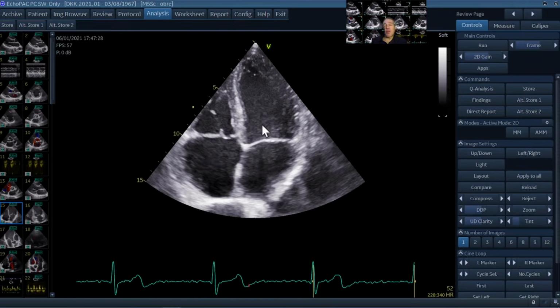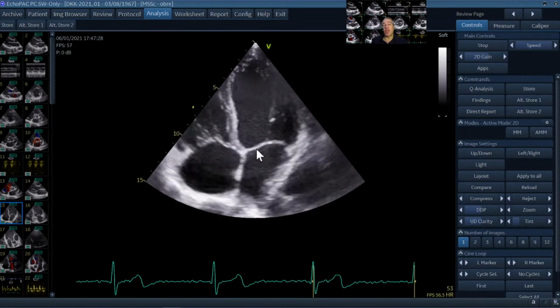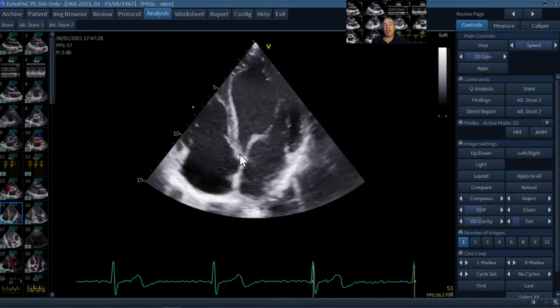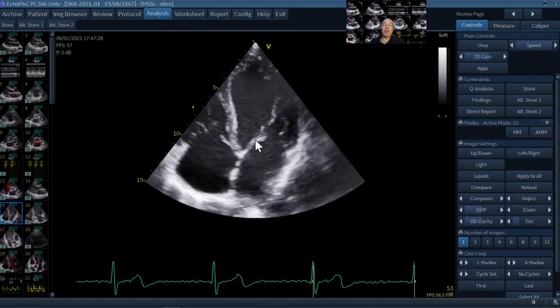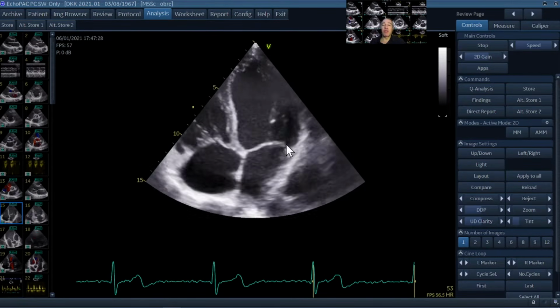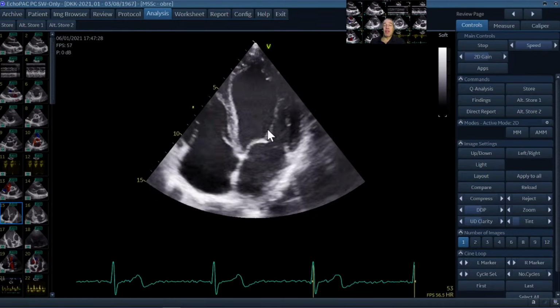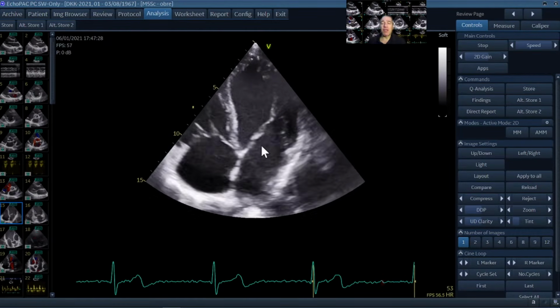You have to know what kind of segments you look at. This is more the inferior septum. This is the lateral wall. We see here the mitral valve, and really in the middle is the septum, the interventricular septum and the interatrial septum. Then we focus on the mitral valve with again an anterior leaflet and a part of the posterior leaflet. You might appreciate the papillary muscles, the chordae, different chordae at the rim of the leaflets and more attaching to the middle of the leaflets.